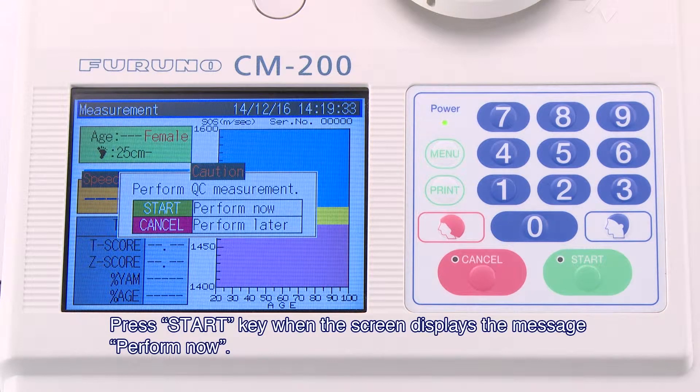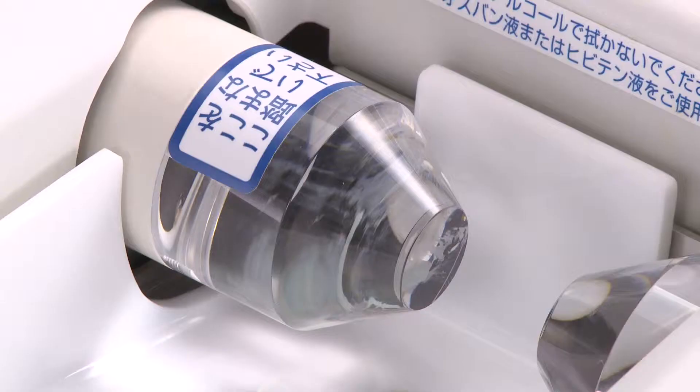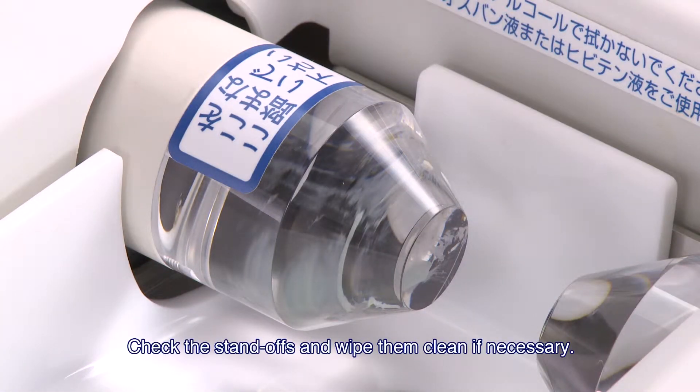Press the Start key when the screen displays the message "Perform Now." The QC Measurement Step 1 screen is displayed. If there is any acoustic gel on the standoffs, it may cause errors. Check the standoffs and wipe them clean if necessary.